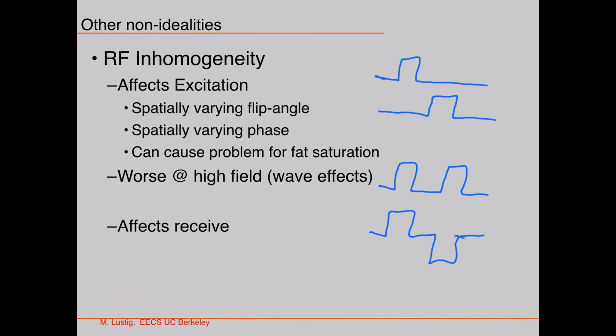Actually, this is n equals 1 time collecting a slice, and this is the same time collecting another slice, right? But here I collect information from both slices at the same time. That's n, and then that's another 1. So effectively, I'm observing the same slice twice as much.